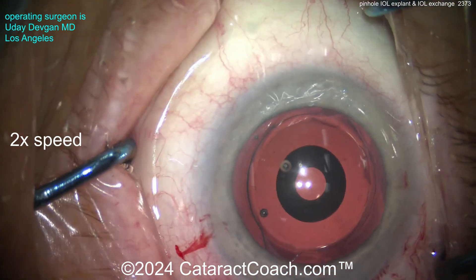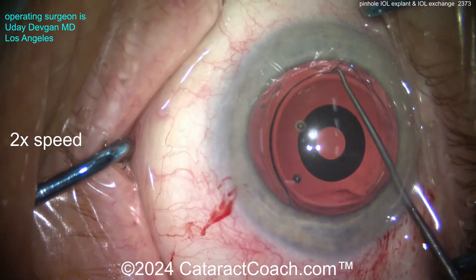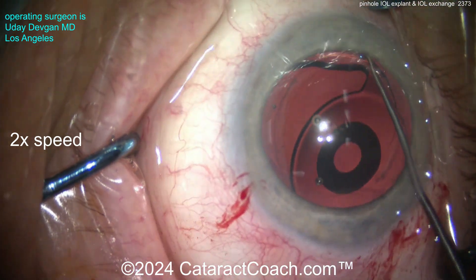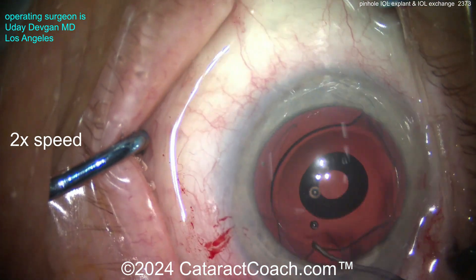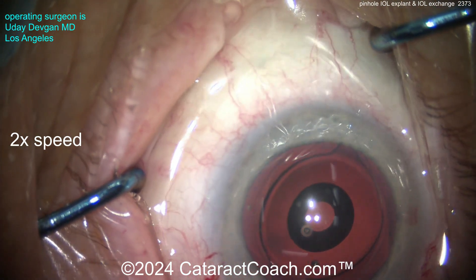The video is sped up at 2x so we can get through it quickly. Once you separate the anterior and posterior capsular leaflets, look — the IOL comes up pretty easily. This is an acrylic lens, but it's thicker than your average lens.